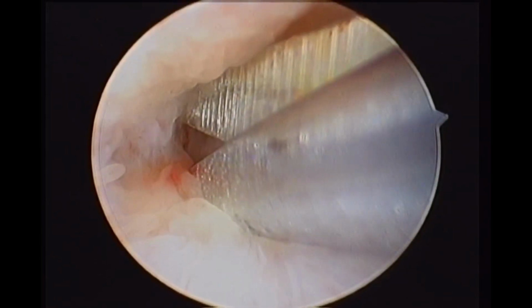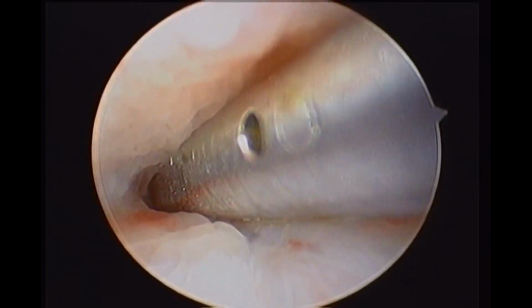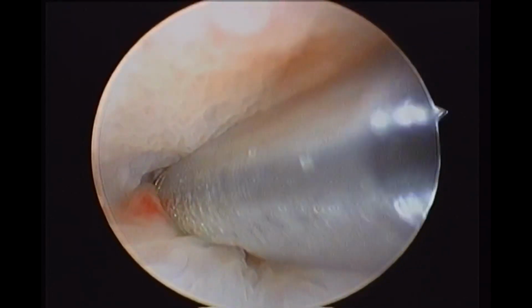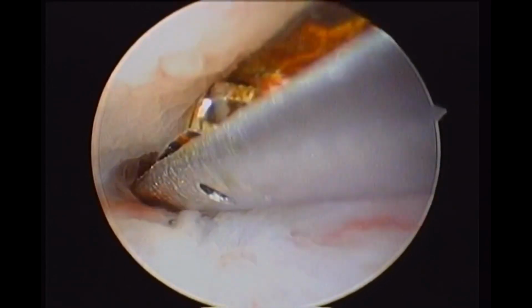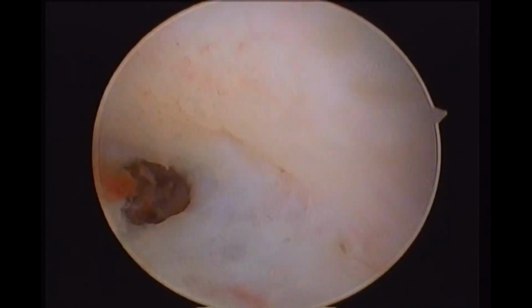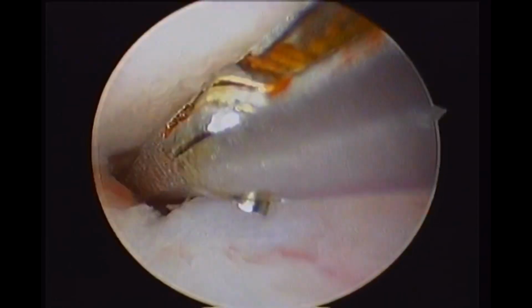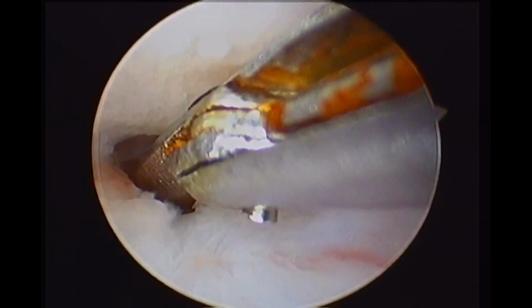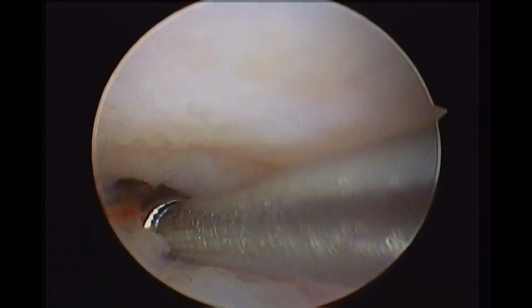Use the scissors as your dilators. Any attempt to do blind dilatation by metal Hegar dilators will eventually end in a false track and perforation. So under vision, use the scissors to palpate, to touch, to probe. Again, this brownish color on the scissors is the betadine antiseptic. So you use the scissors as your tool to feel the tissues.